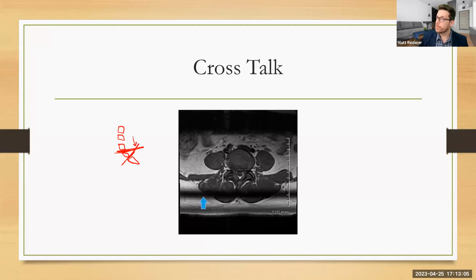And if they overlap, I get this dark line of suppression across my image. Now, there's not much I can do if I'm angling through these disc spaces, right? I'm kind of stuck with that angle. But as long as this line is not in what I'm imaging, like the spinal canal here, it's fine. We would never repeat anything for this. This is just something that we would expect to see in our image, but it's an artifact. It's caused from overlapping slices. Slice overlapping another slice.